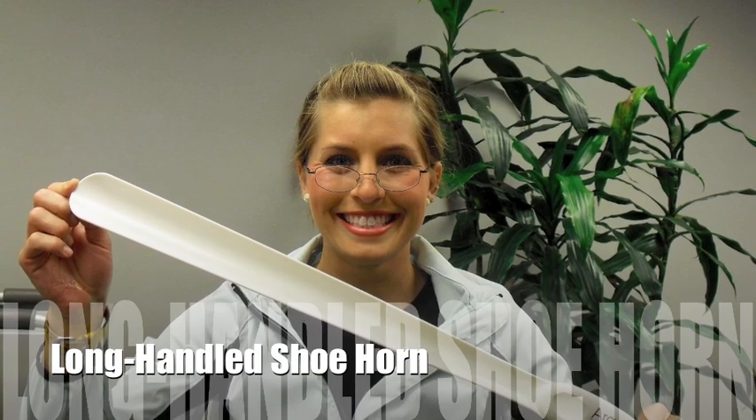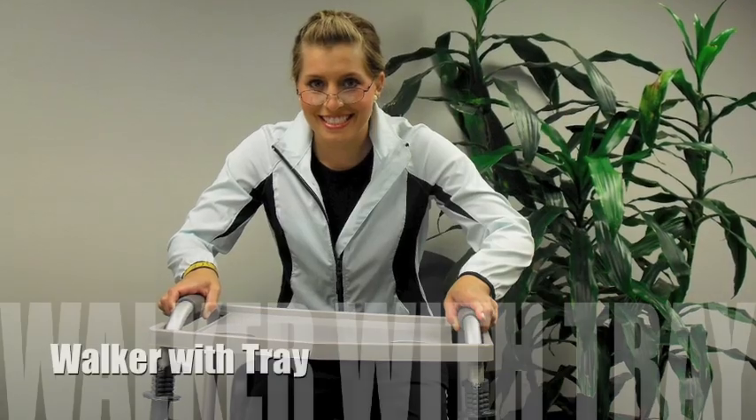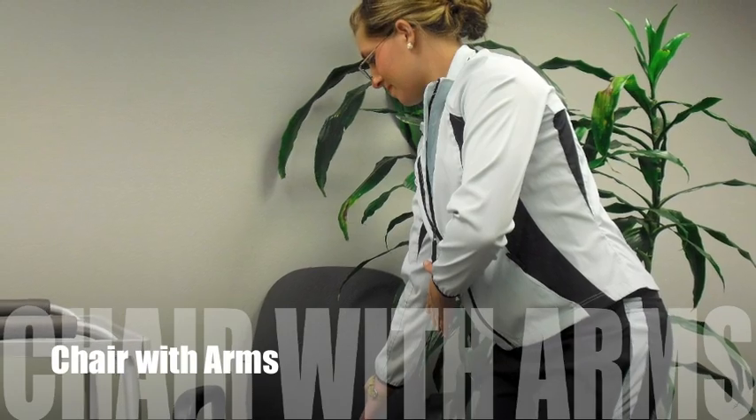Before we get started, we'll need some necessary equipment: a long-handled shoehorn, a reacher, a sock aid, a walker with a tray, and a chair with arms.